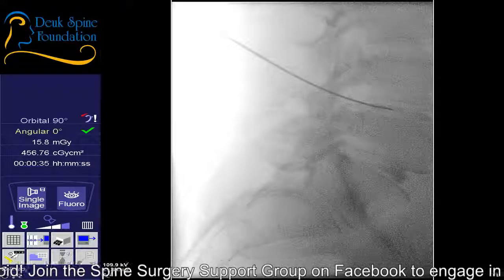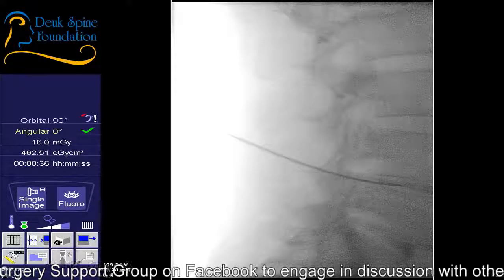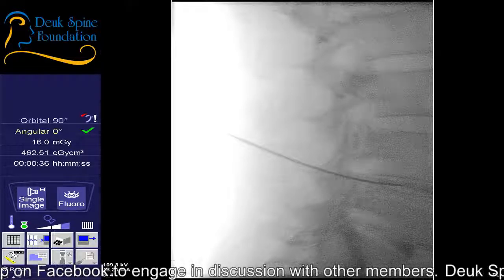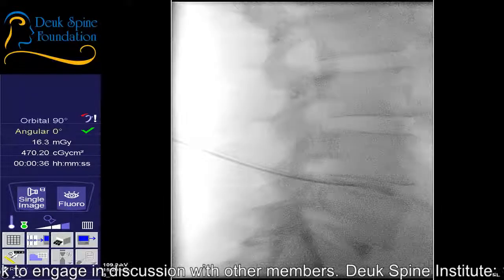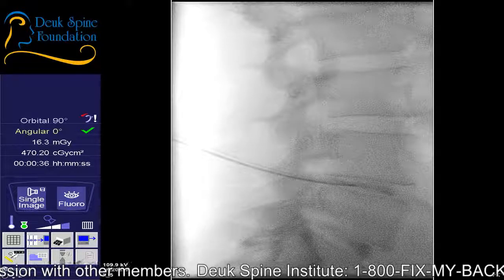All right. So what do we need to do to get a better picture? Bring it north, I guess, and drop the fluoro. Bring the table up a little bit. Get a shot. That's pretty good. All right, you can relax, my friend. Yes. Guide wire.